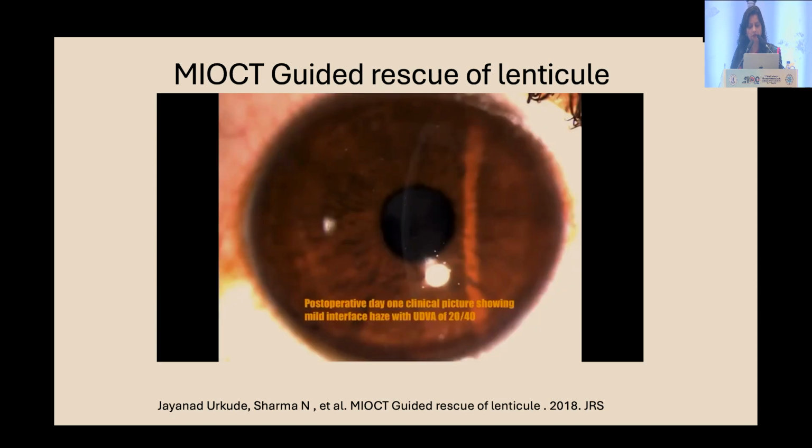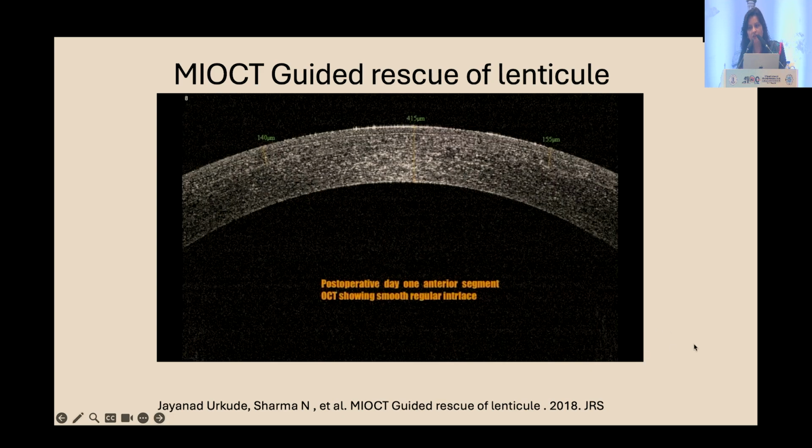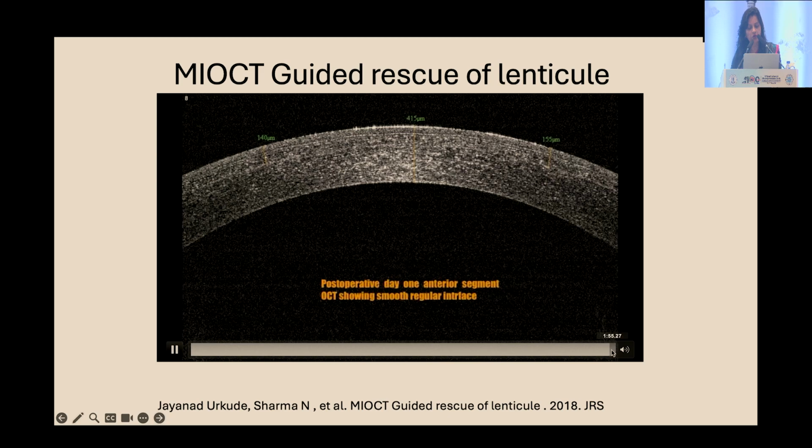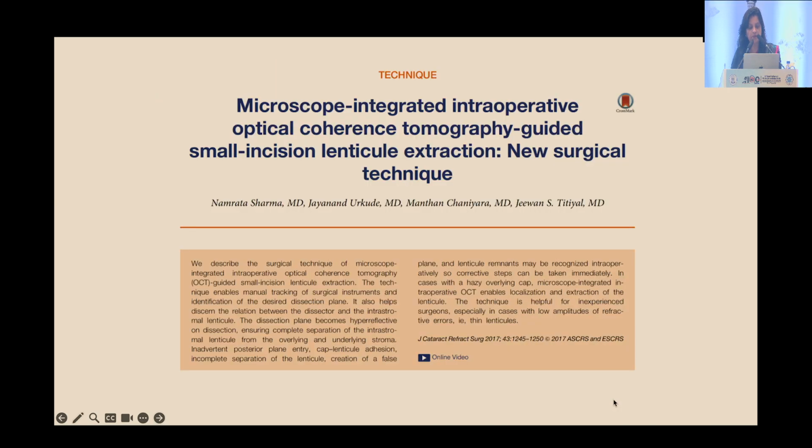The only problem is that our two machines are on different floors, so we have to shift the patient from one floor to the other because the intraop OCT microscope is not on the same floor. But current machines have the intraop OCT microscope integrated into the lenticular platforms, and I think that is the way to go, especially now that we have almost all shifted to lenticular surgeries.